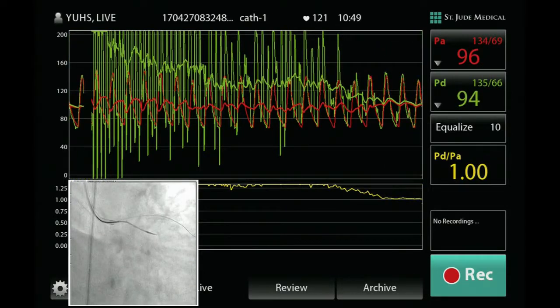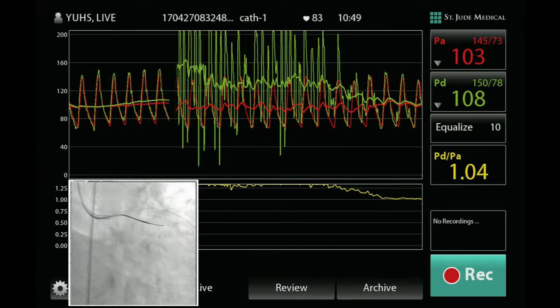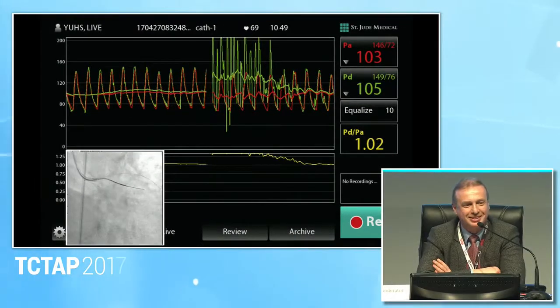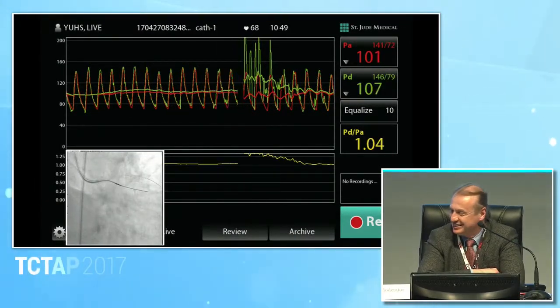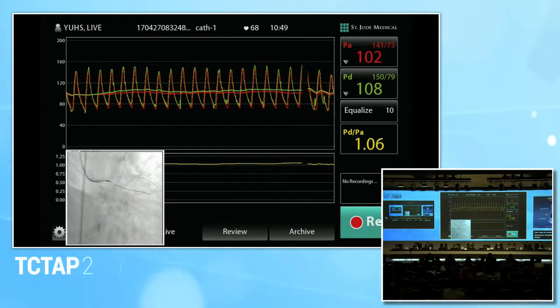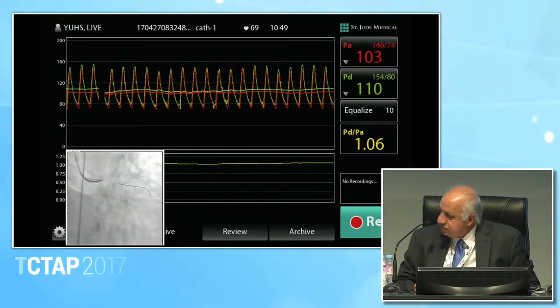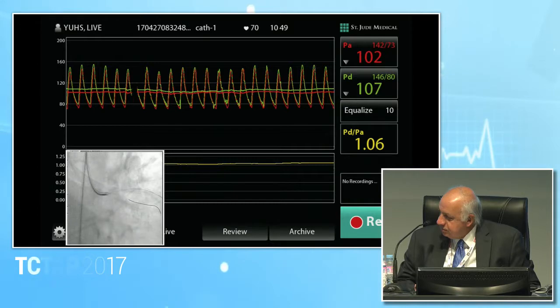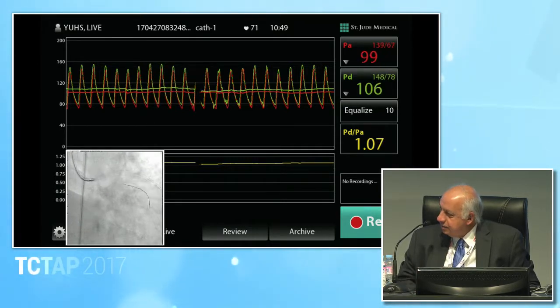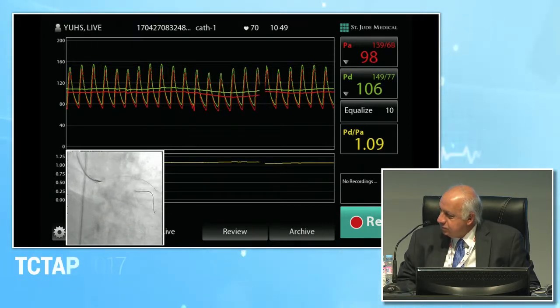Looks like the patient is very calm and hemodynamics is good, and because you are also so calm, that means the procedure is going very well. For the sake of discussion, regarding iFR and FFR, do you think that in the future we're going to start with iFR, and if there is no ischemia, finish the job, or do we have to stick to FFR because there is a contradiction between the two trials?